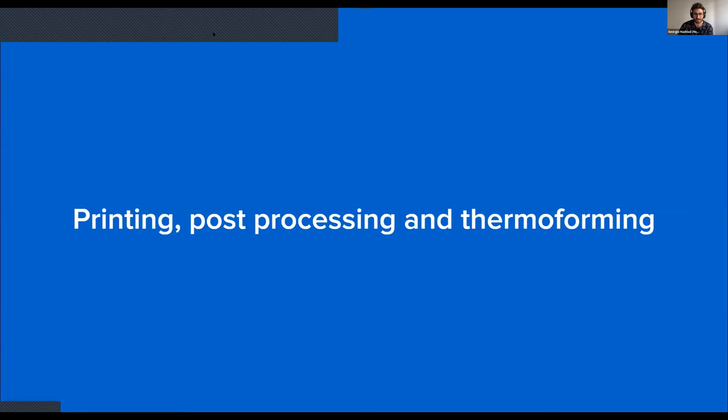Yeah. So one of the repetitive questions, I think, concerning Dr. Jan and Sune as well, is regarding the hollowing. When you're exporting the models, the setups in Clearliner Studio, can you hollow that? Yes, the models can be hollowed afterwards, either using third-party software, or some of the printing software is also able to hollow the models prior to printing.